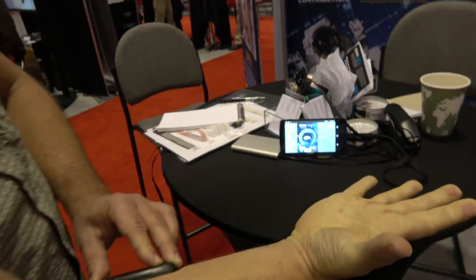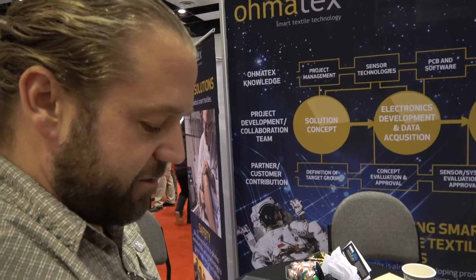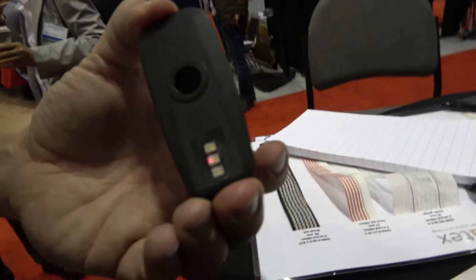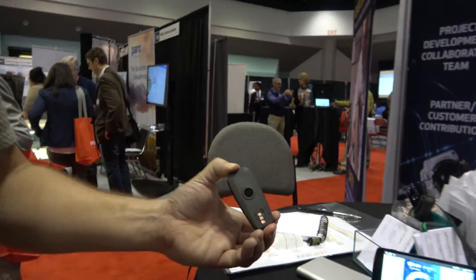So what's the usage for this? We've developed it for European Space Agency, for the astronauts, to surveil the muscles during their stay on the space station. It works with a near infrared sensor — red light in different wavelengths.